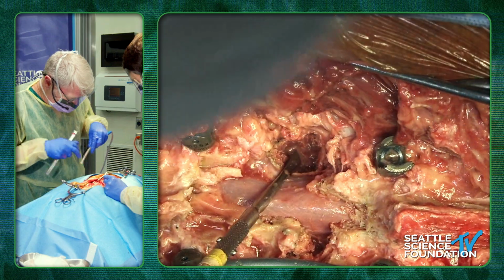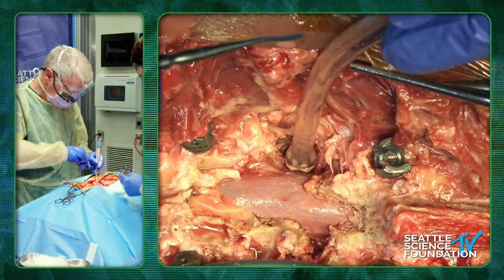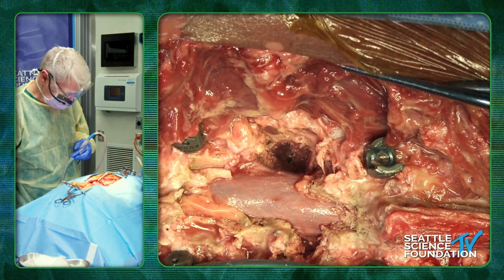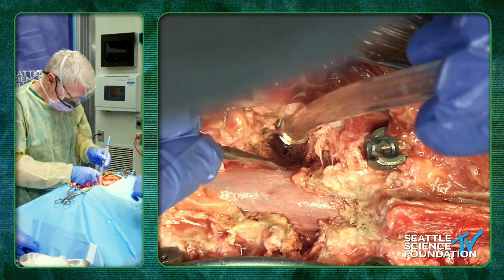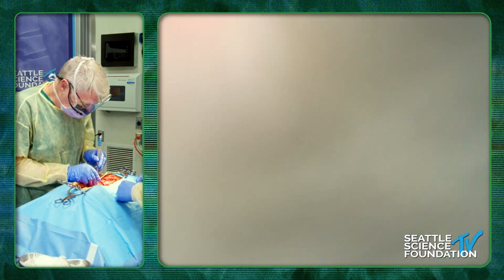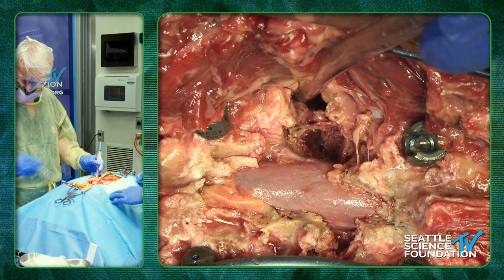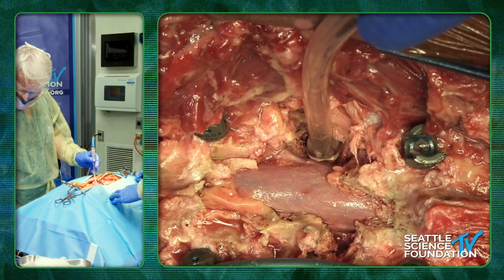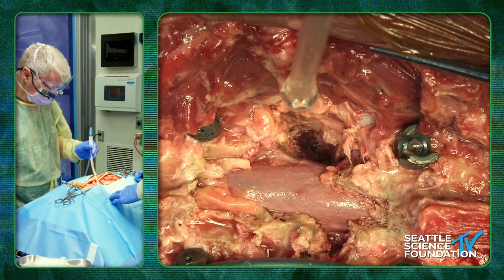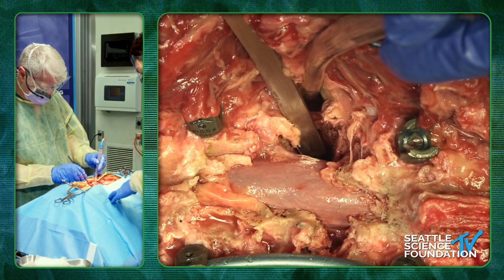Okay, so you can see we have a nice cut through the lateral body in a triangular fashion here. And now what we're going to do is we're going to keep that cut going on both sides all the way through. So I'm going to leave the posterior wall. Is there a smaller osteotome? So I have a small osteotome here. We're going to work under the posterior wall. So we're leaving the posterior wall intact.